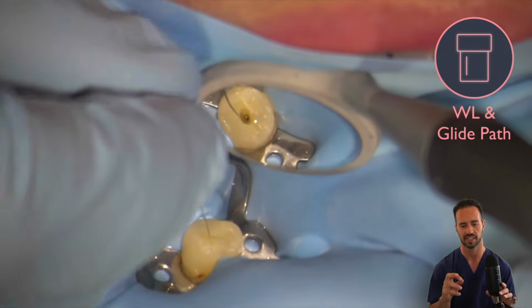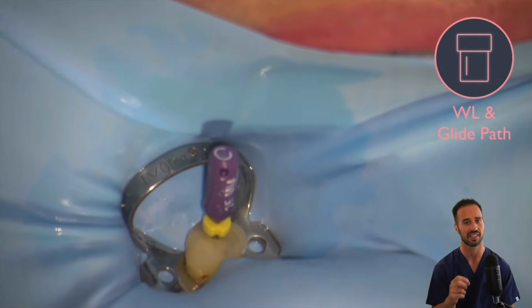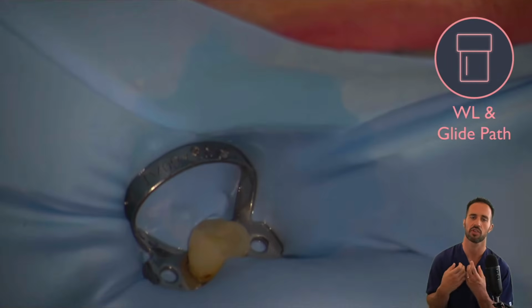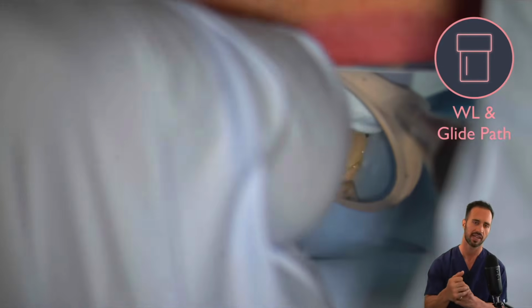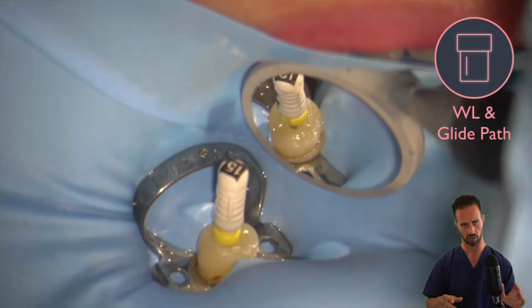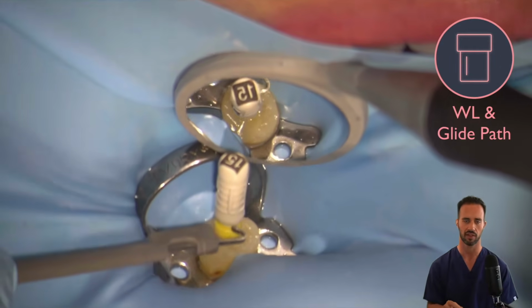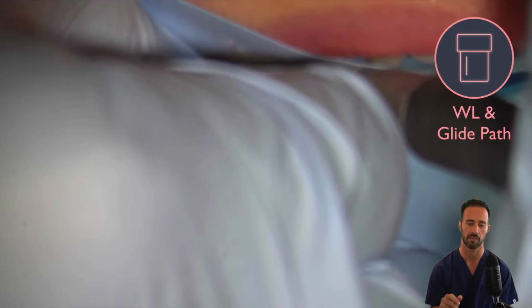So we have a size 10 file that we're introducing into the root canal, and you can see that this is a C file. C files I would recommend for sizes 8 and 10 because those are the files that oftentimes you're really working to get down to the apex with, and the C file gives you a little bit more strength, it's a little bit more rigid, and you don't really need this for the larger files. So sizes 15 and above, I would encourage you to use K files, which is what you see here with the little square on the top. That's the K file symbol, and we're just getting our working length with our electronic apex locator.